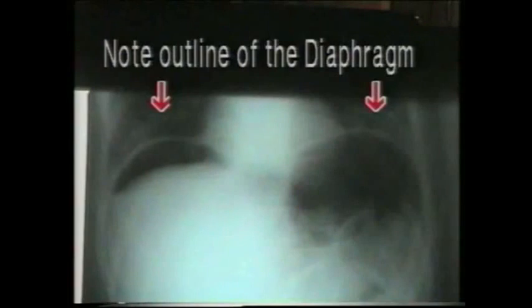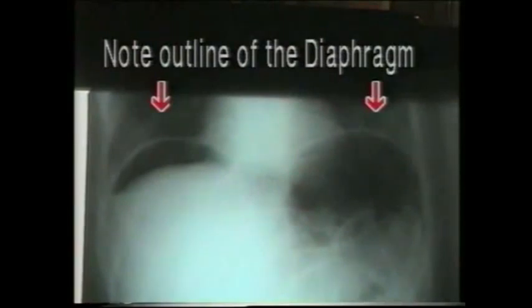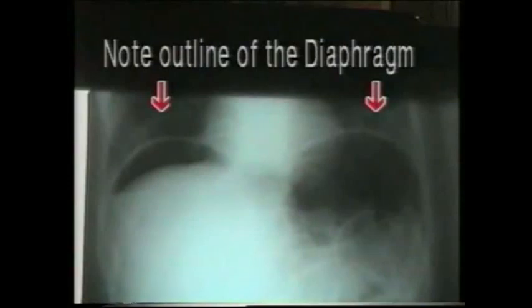This is a standing x-ray of the abdomen showing gas under both the domes of the diaphragm. Note the thin, smooth dome-shaped outline of both the diaphragms. On the left side, this outlining of the diaphragm tells us that this is not the stomach bubble, but it is free gas under the diaphragm.